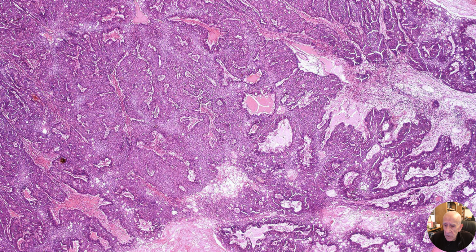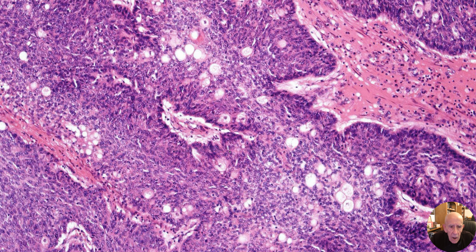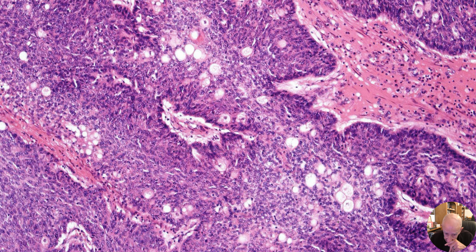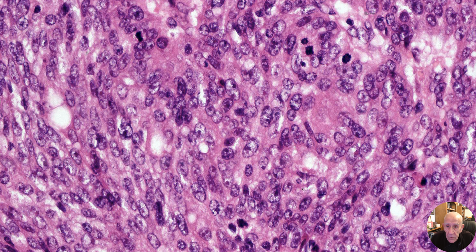And then at the other end of the spectrum, one has this sort of tumor where the degree of pleomorphism is much less, although sebocytes are very, very scanty. Most of the tumor is composed of basaloid germinative cells. And there's a close-up view there where there is a bit more obvious sebocyte formation, and a close-up view showing lots and lots of mitotic figures, 1, 2, 3, 4, 5, 6, 7 or more mitoses, significant pleomorphism, and very prominent nucleoli, so it's easy to recognize that as a sebaceous carcinoma.